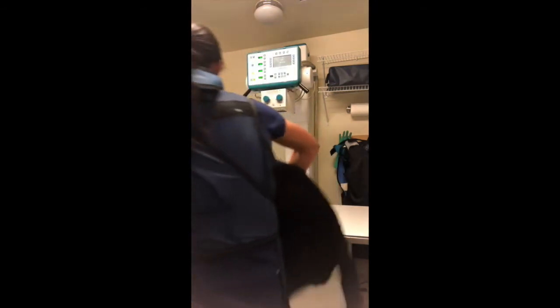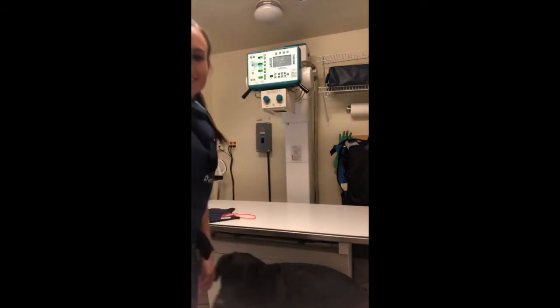In procedures for positive contrast upper GI studies such as BIPS and barium, the cat's GI tract digests the barium almost 4 times faster than the dog's. Although several factors come into play, it can take up to 4 hours for the barium to travel through the upper GI tract in dogs and only 1 hour in cats.